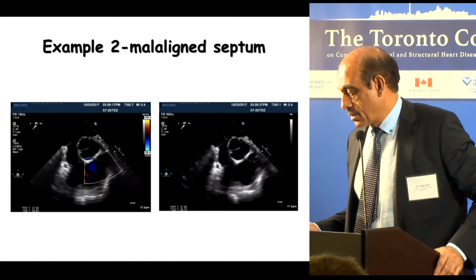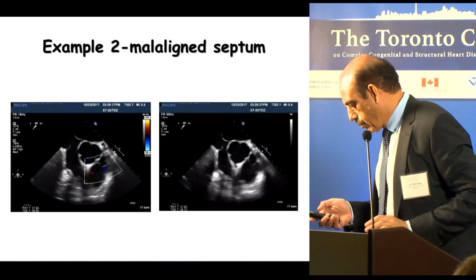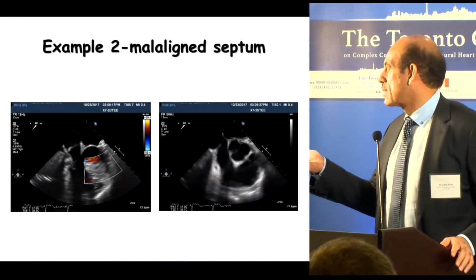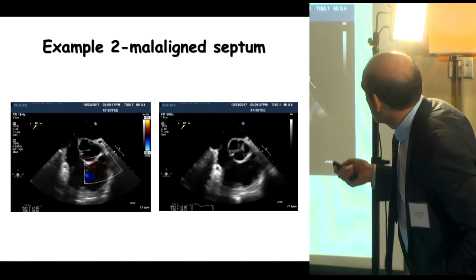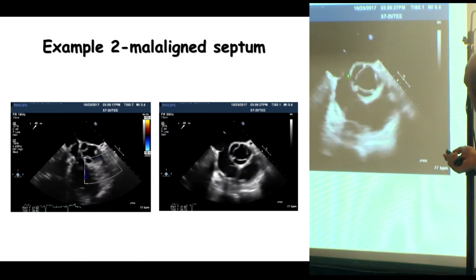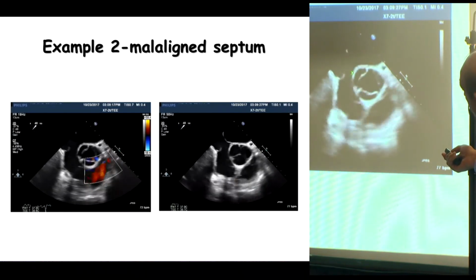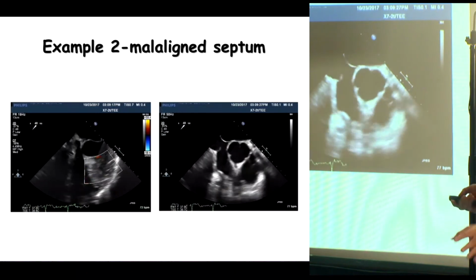Yes, sir. Okay. Show me where the septum is. Is there a pointer I can use? Yeah, because I also don't know. So this is a non-coronary cusp. This is subtle. Normally the septum should be in this area, right in the middle, by the definition that you described.